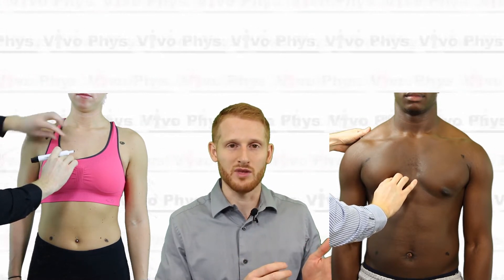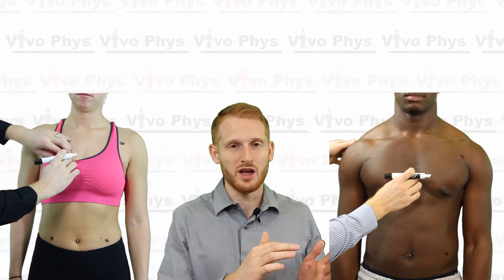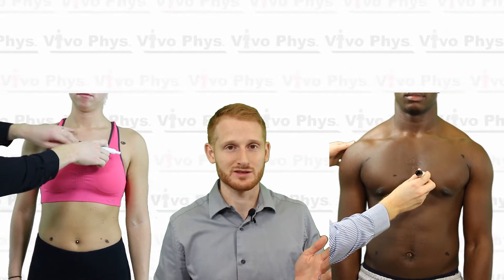Walk your fingers down starting at the clavicle. Usually you won't feel a whole lot in the first few inches because there's a lot of muscle and tissue covering the bones, but eventually you'll feel a big divot. That big divot is typically the second intercostal space — the space underneath the second rib. Keep walking your fingers down until you find the third and then the fourth intercostal space. The fourth intercostal space on the right side of the chest is where the V1 electrode goes.